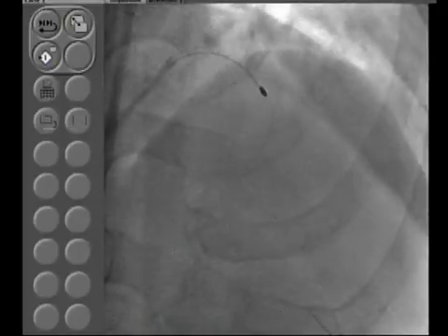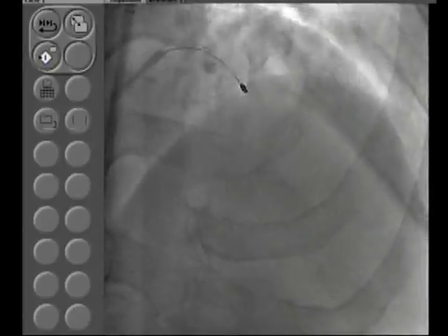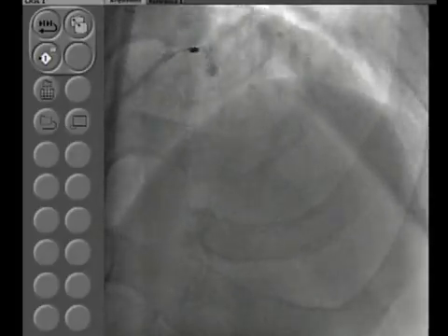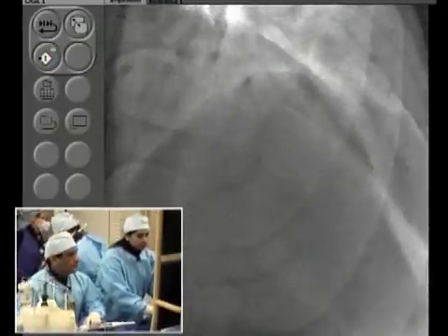Okay, there you made the pass. But same, it has to be a smooth, nice pass, no jump with the bar. So, excellent demonstration of techniques. Truly the purpose of doing a case like this is that you start with the device, you think it is going to work, you take a step backward and do it safely. Get the wire. Yeah.